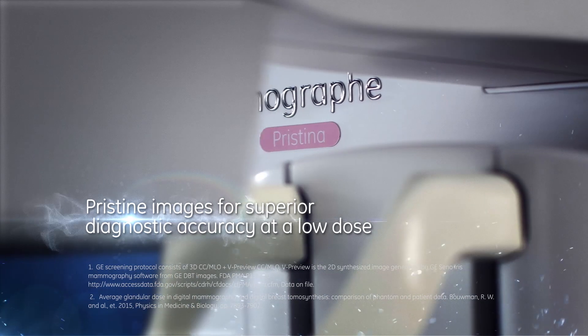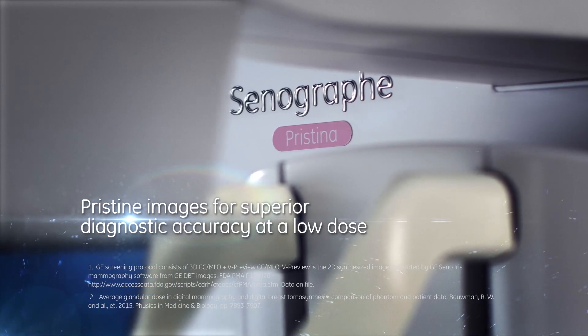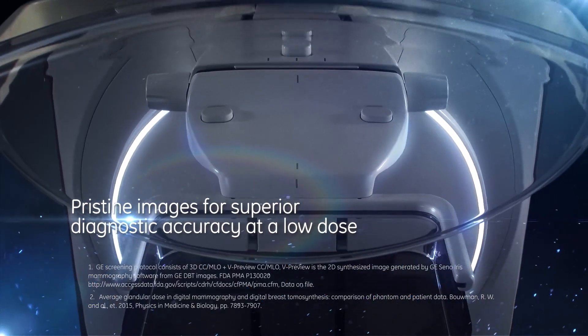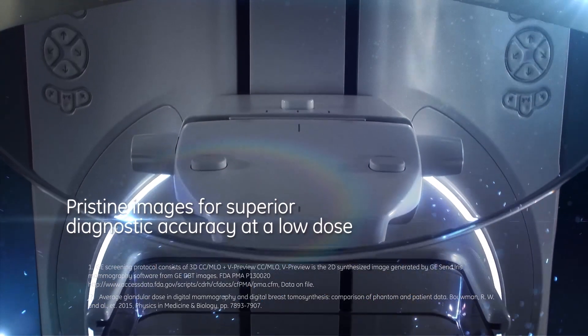3D capability provides exceptional image quality at the same dose as standard 2D mammography.